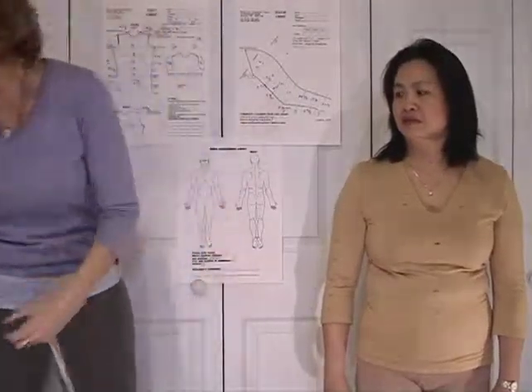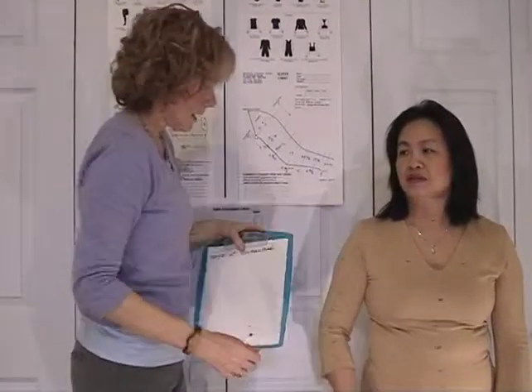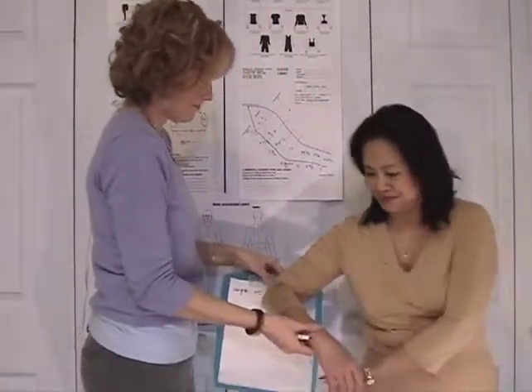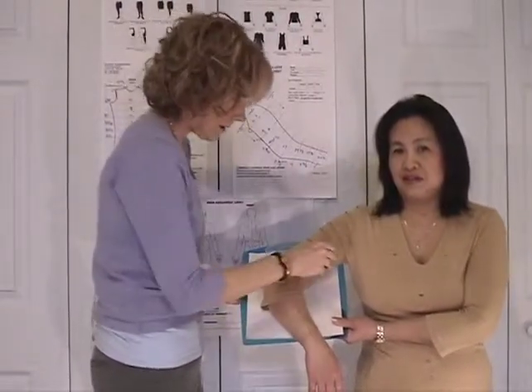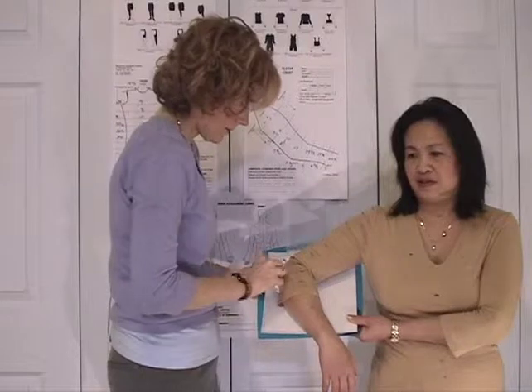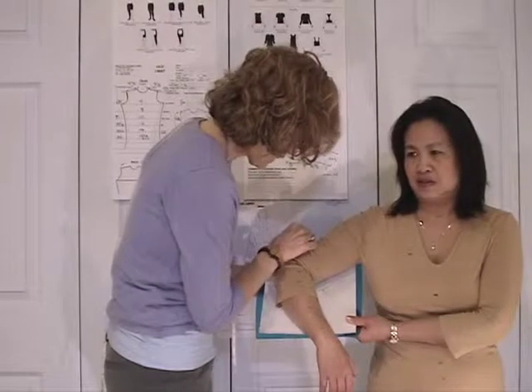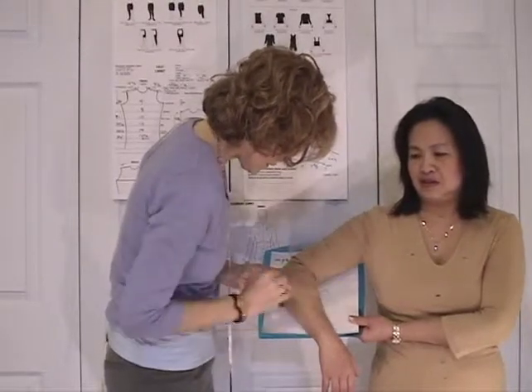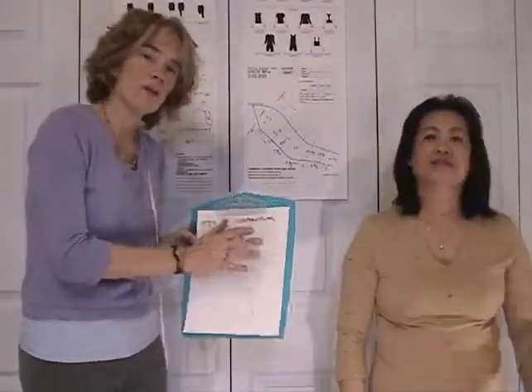One other situation you might encounter is a patient with a contracture. In that case, take the patient's arm, put a clipboard behind it, and trace the angle of contracture. Make marks so you can accurately identify where you took circumferences, then send that to us and we'll angle the pattern to the degree of contracture.